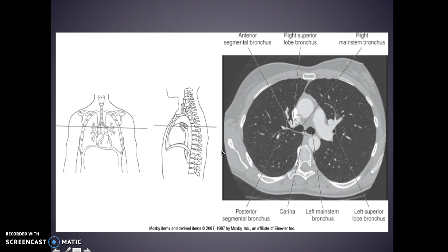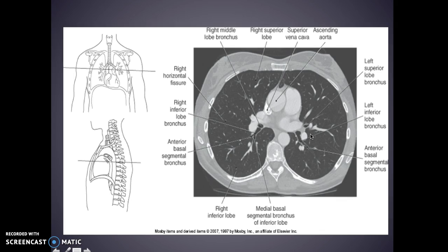Looking here, the main thing is your carina with your right and left main stem bronchus. Here's your superior vena cava with your ascending aorta, and this should be your pulmonary trunk — that's about it for this image.